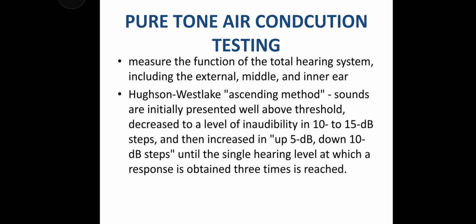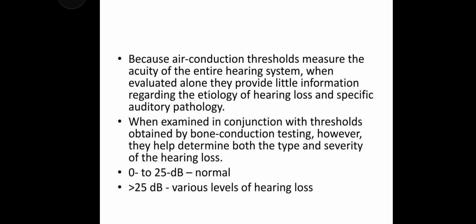Hughson-Westlake ascending method. Sounds are initially presented well above threshold, decreased to a level of inaudibility in 10 to 15 decibel steps, and then increased in up 5 decibel and down 10 decibel steps until the single hearing level at which a response is obtained 3 times is reached.